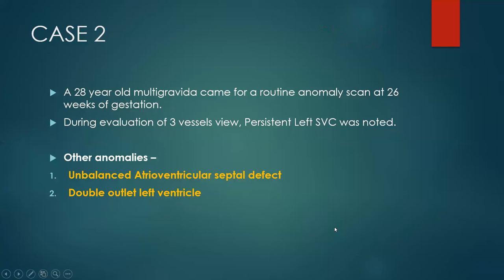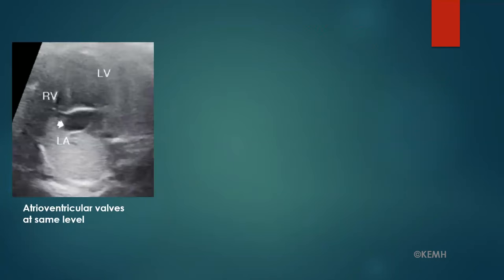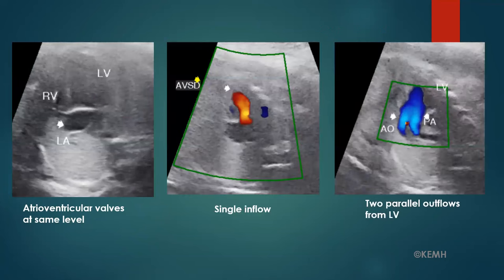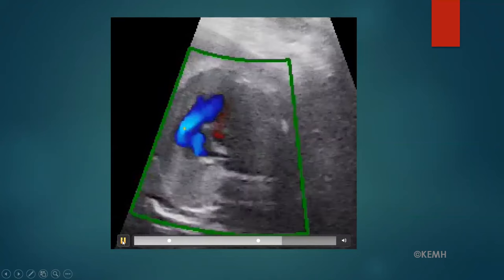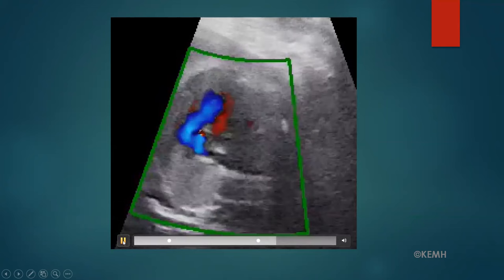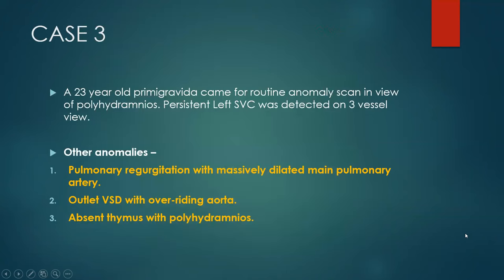Case 2 is a 28-year-old who came for an anomaly scan and PLSVC was noted. This image shows PLSVC and right SVC on either side of the aortic arch. The fetal heart also shows AV valves at the same level, a single inflow, and two parallel outflows arising from the morphological left ventricle, suggestive of unbalanced AVSD with double outlet left ventricle.